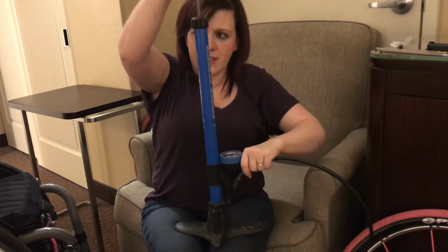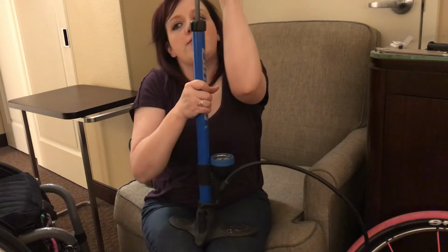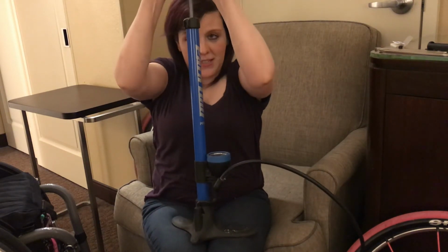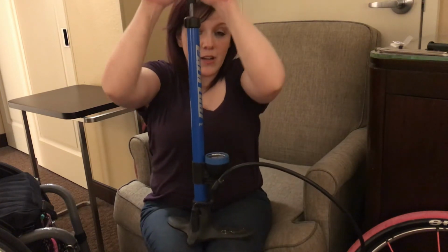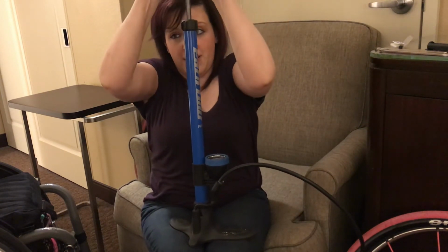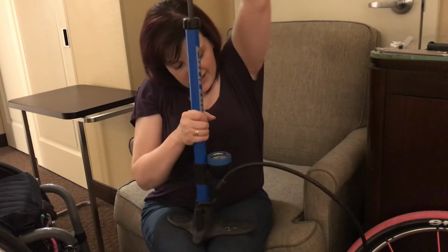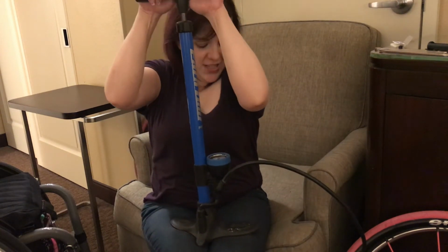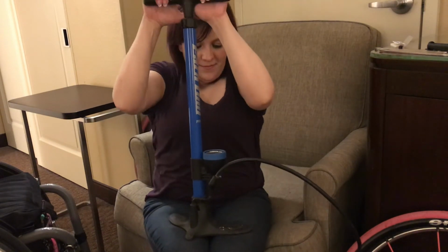And I'm getting a little bit of resistance. I'm getting resistance again. It might be easier for some of you to sit it back on the floor, but if you have a hard time getting up and down, it might be better to do it like I'm doing it right now. And right now I'm only about halfway to where I need to be. A little under halfway actually. I'm at 50 PSI. We want it at 110.